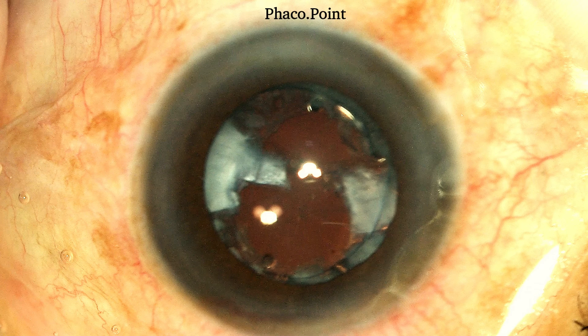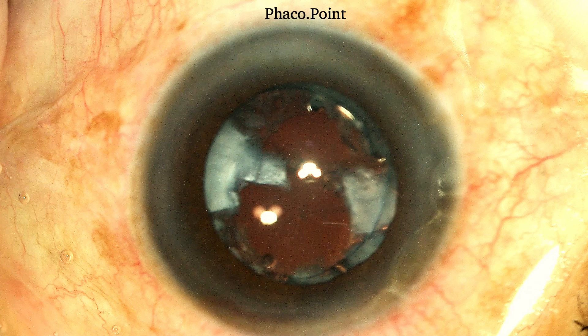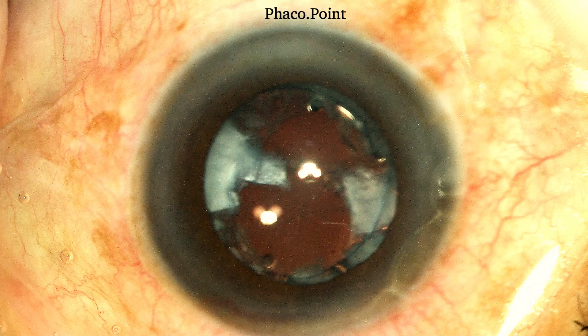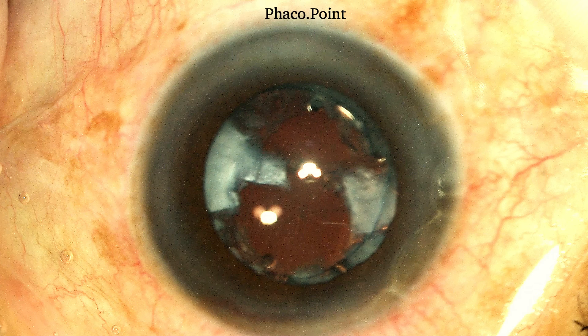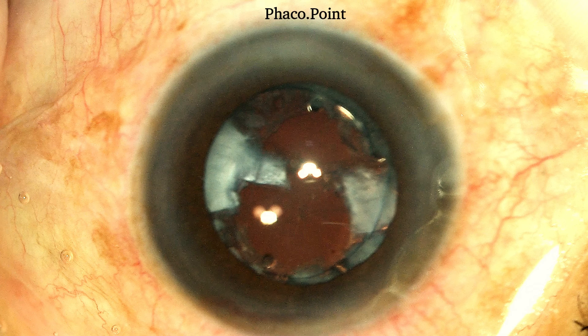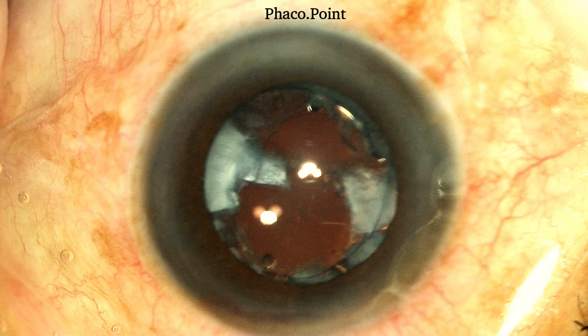This patient was dilated on day 5 after surgery and this is what we found. There was significant residual cortex all around the periphery, but if you look more closely, the patient actually had an associated posterior capsular rupture nasally.